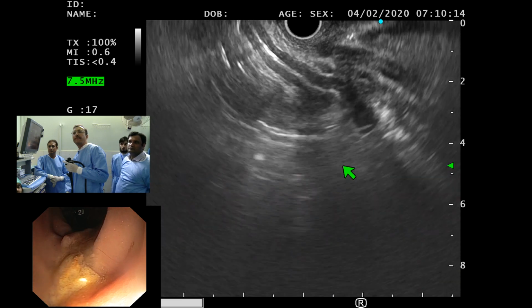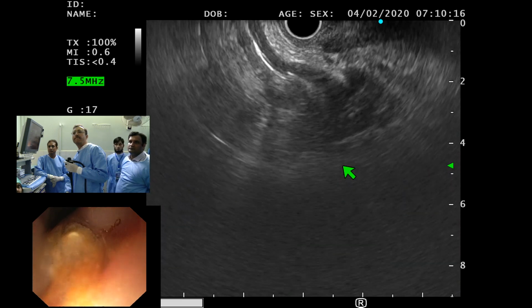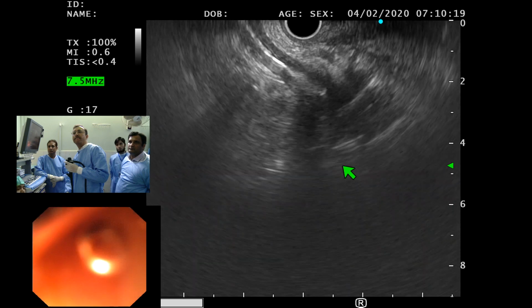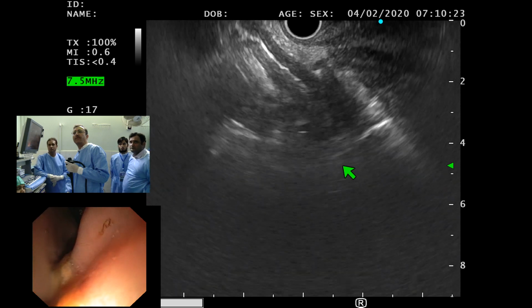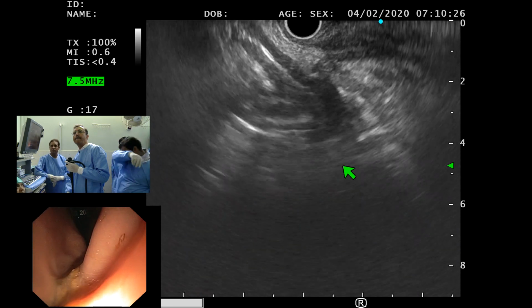Now, can you see better? Yes, we can see that. But still, I don't see any mass around the lower end of the stented area.